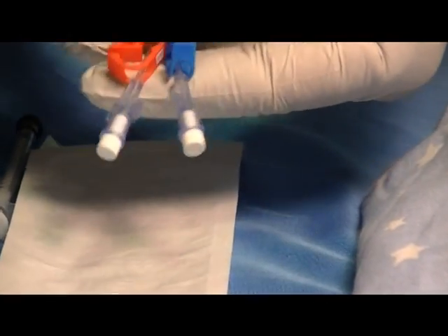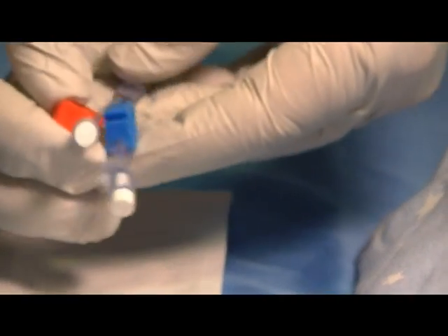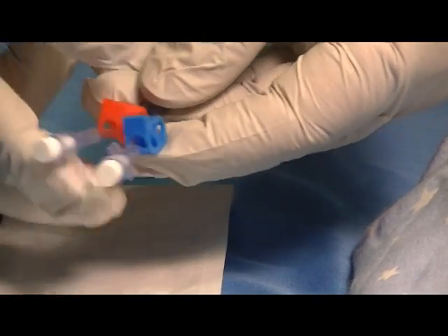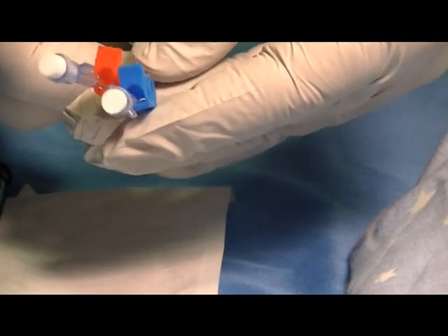At that point, you would clamp both the red clamp and the blue clamp onto the line. Then prepare for insertion.